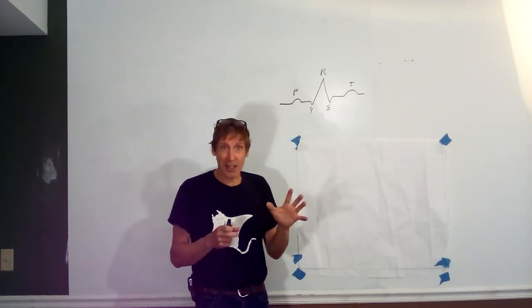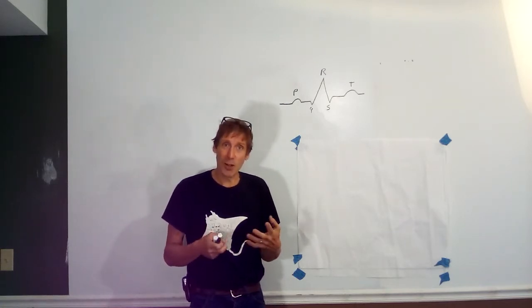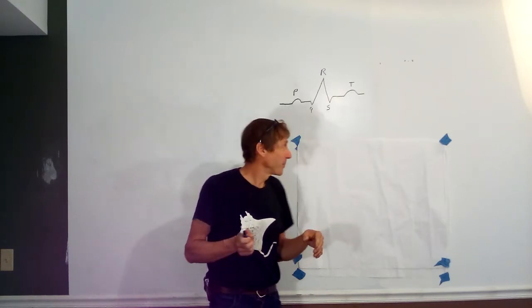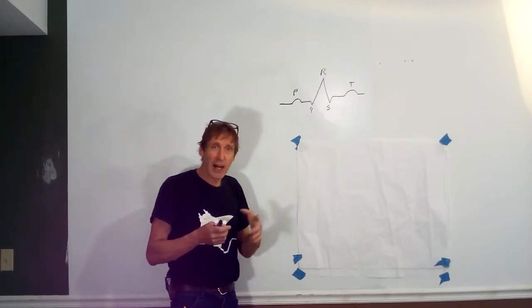If I can, I've got a nice video that goes along with this. It shows you the heart beating, it shows you an EKG, and they induce all these arrhythmias. If I can get it uploaded, I'll give that a try. I'll post it if I can get it. All right, so normal EKG we've got. Now, some of the abnormalities, they've got names.